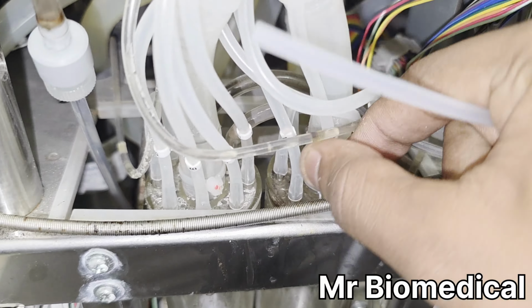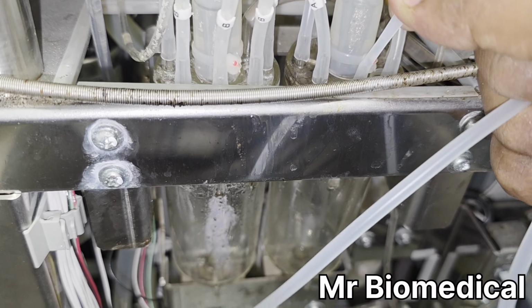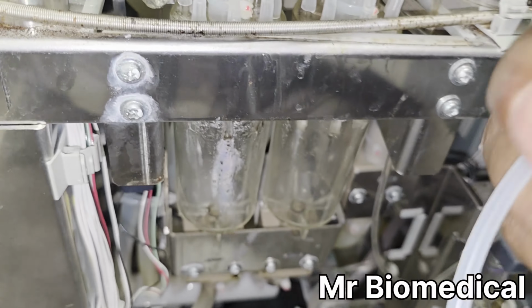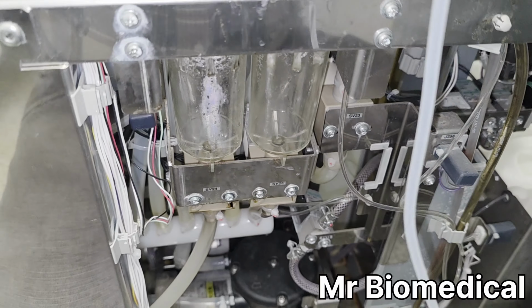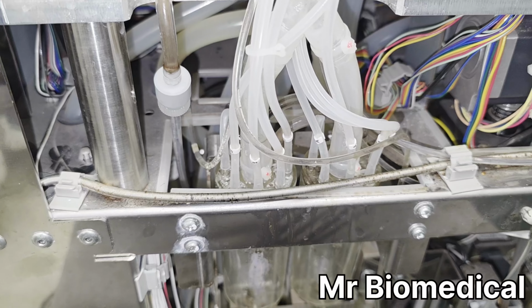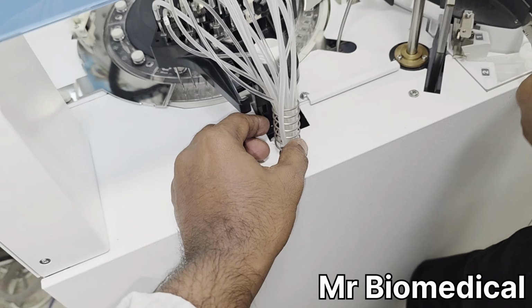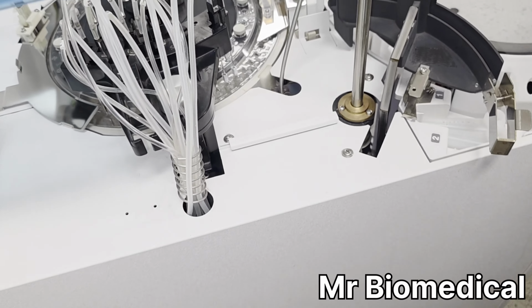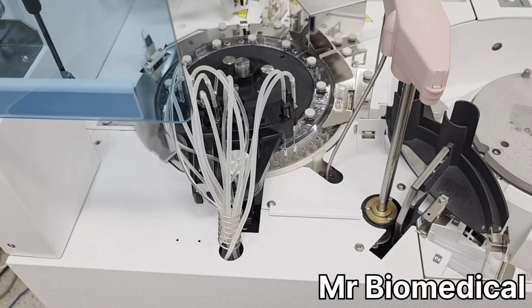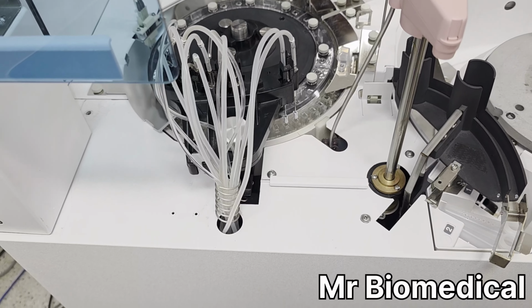As you can see, I'm removing the faulty tube from the machine, from this end to that end, and replacing it with a new tube. Make sure the new tube is clearly fit to the probe. Okay, and now I fix the new one.